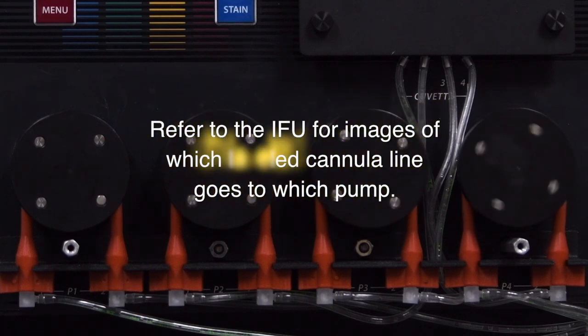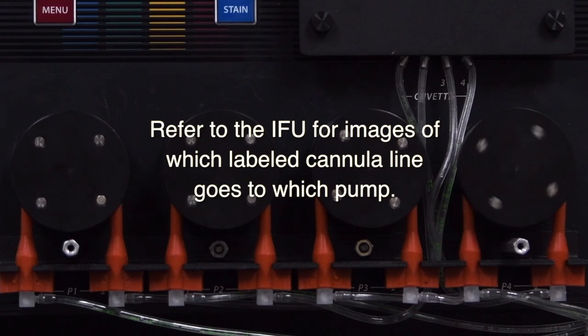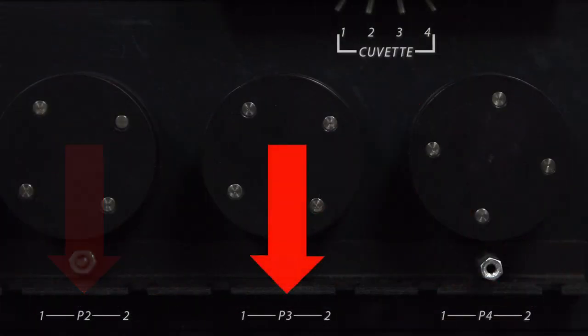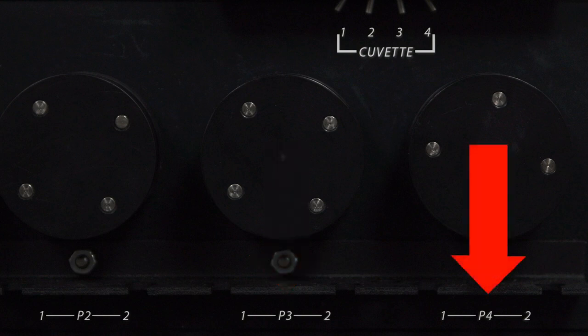Refer to the IFU for images of which labeled cannula line goes to which pump. There are numbers below the metal connectors that will clarify which pump roller it is responsible for.